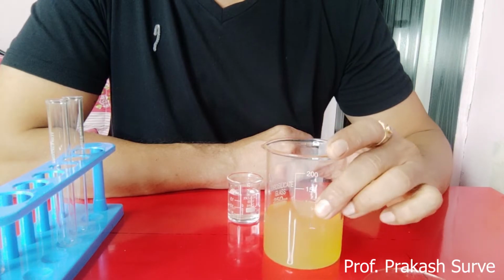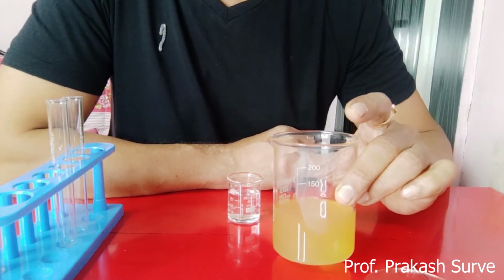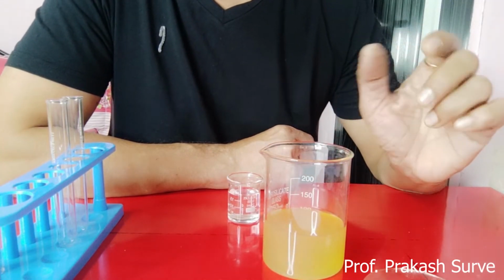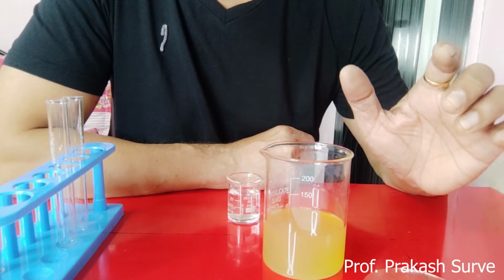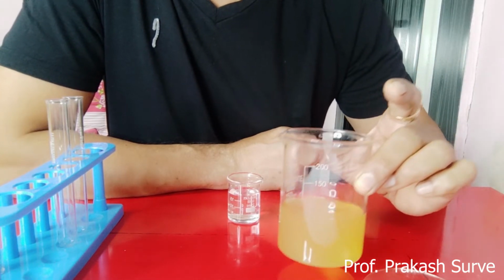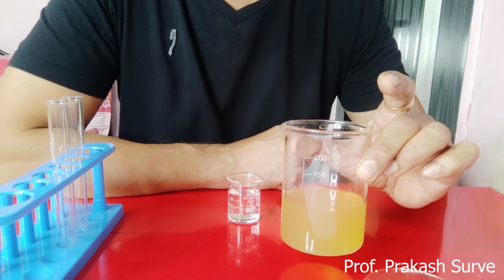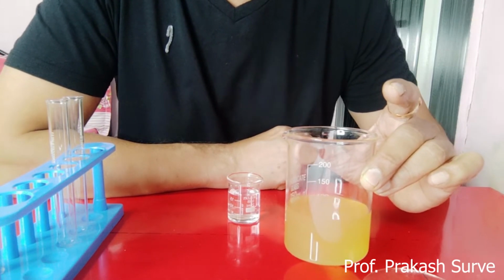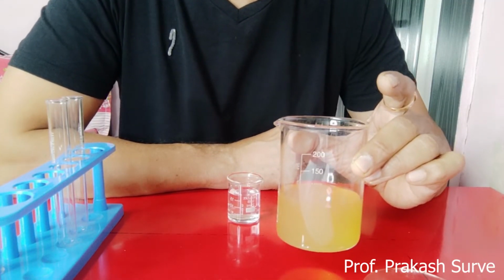The bile salts are not normally found in detectable quantity in the urine. More than 90% of the bile salts are actively reabsorbed by the body. The liver normally clears 20 grams of bile salts from the blood each day. Due to liver infections like jaundice, the bile salts are produced in much larger quantity. The salts are then excreted as part of the urine, so that we can detect that the person is suffering from jaundice.